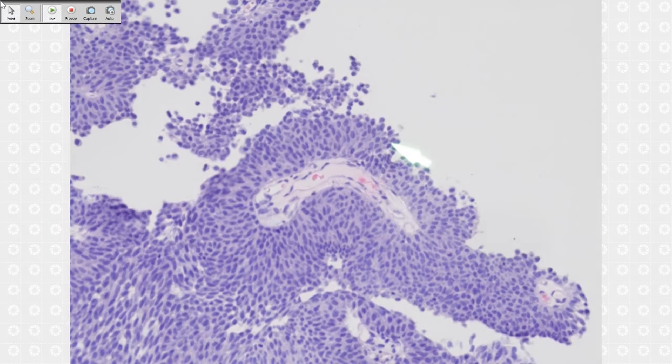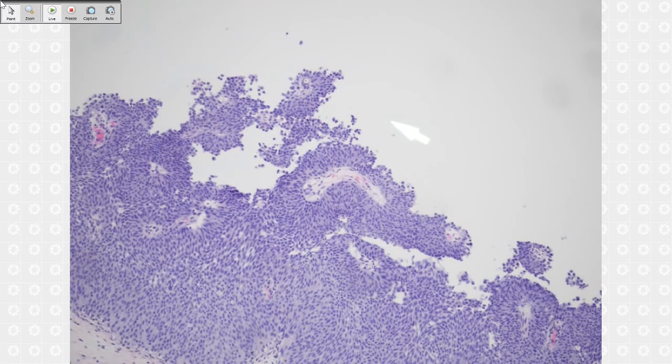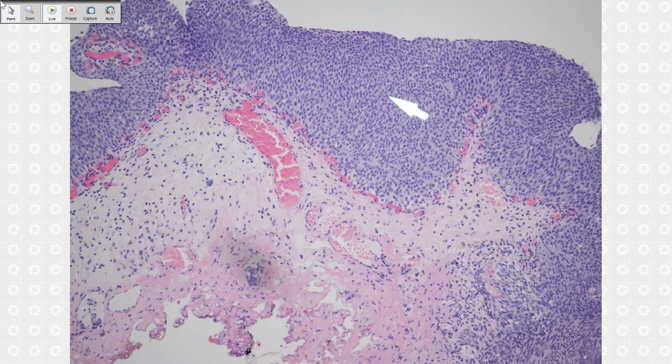Agree. So what are we going to call this one? Low grade, high grade, or atypia? Low grade, right? Because it's papillary. So I remember this morning Dr. Hayes mentioned urothelial proliferation of uncertain malignant potential. It's kind of a new entity. What does that mean? It means you have a thickened urothelium with either no or minimal cytological atypia. What's the meaning? We don't know. So usually this lesion is found in patients with a history of urothelial carcinoma on follow-up. Do you know what can be happening?